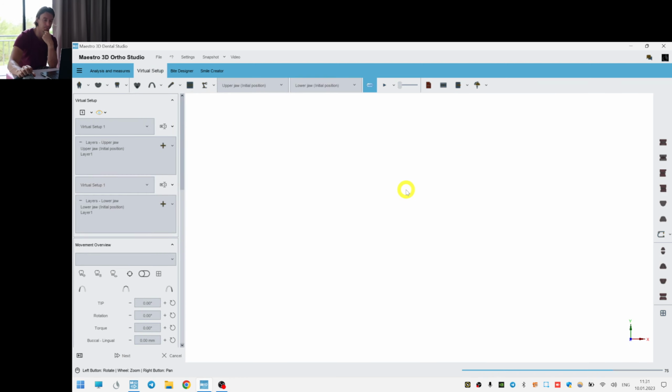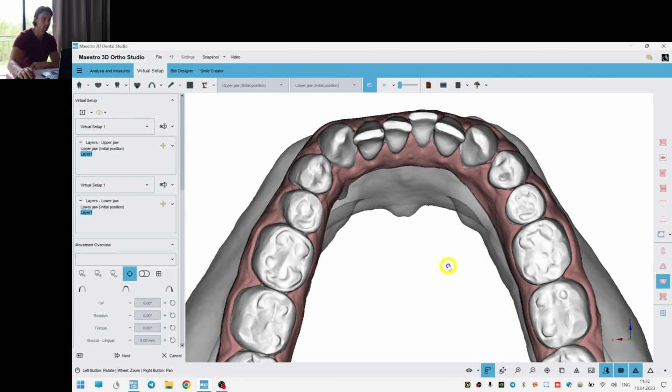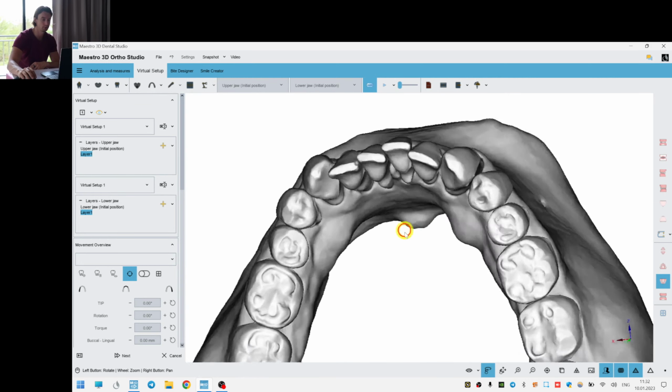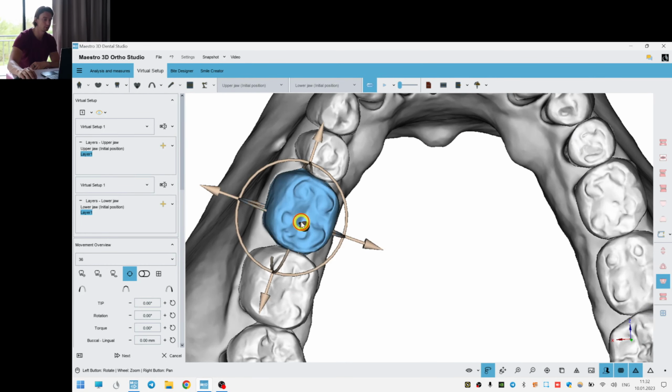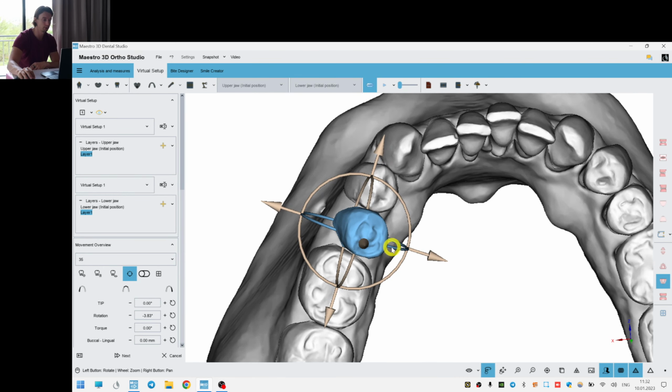So here we have crowding on the lower arch, and let's start with trying to fix it. So let's expand. I don't expand the third molars because it's just not possible with the aligners here. We can even move them a little bit lingually to create more tension in the aligner. I think we should remove the gingiva, remove the transparency on the bone to be able to see if we are still inside the bone or we are already outside of it when moving the teeth.